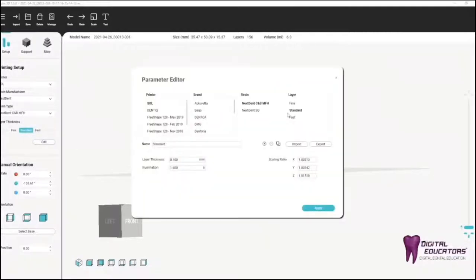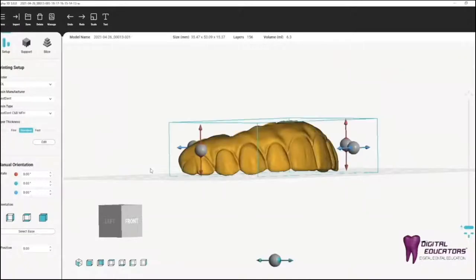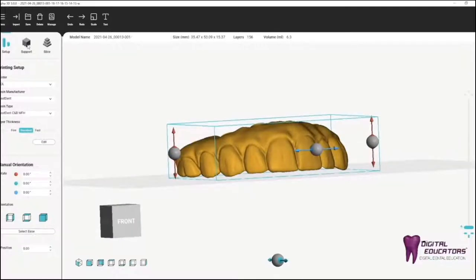The next thing we're going to do is choose the quality or the layer thickness. And in this case, we're going to choose a layer thickness of 0.1 millimeters. There's no reason to print at a higher resolution than this for a temporary hybrid. So this is considered standard in the software, so we'll choose a standard mode here.